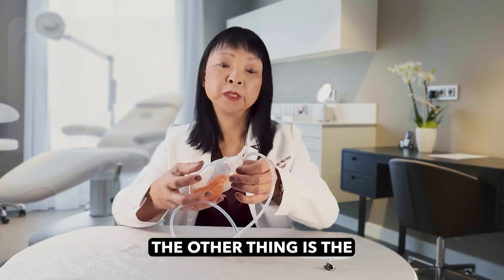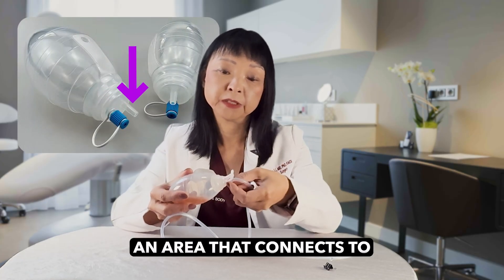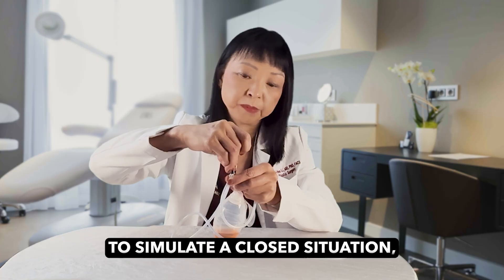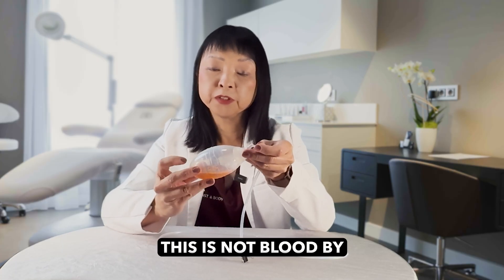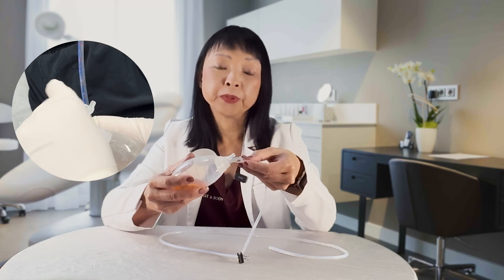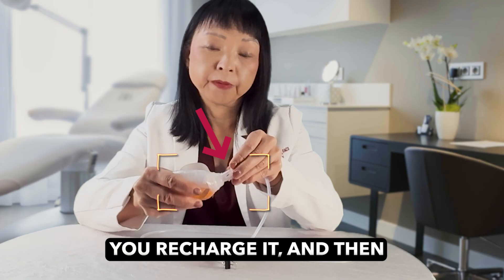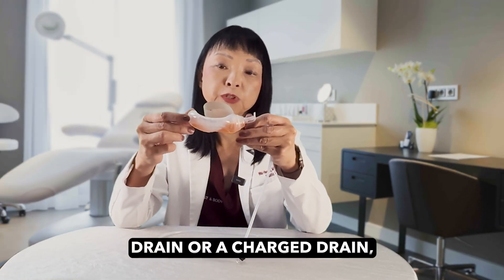The bulb itself has a cap that you're going to manage and an area that connects to the tube. So you have to undo this cap. This is not blood, by the way — it's just some liquid with some food dye in it. So you undo the cap, you empty the drain, and then when you compress the drain, that's how you recharge it. Then you put the cap back on. This is a compressed or charged drain.